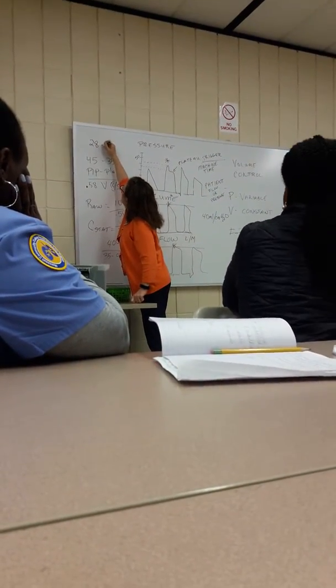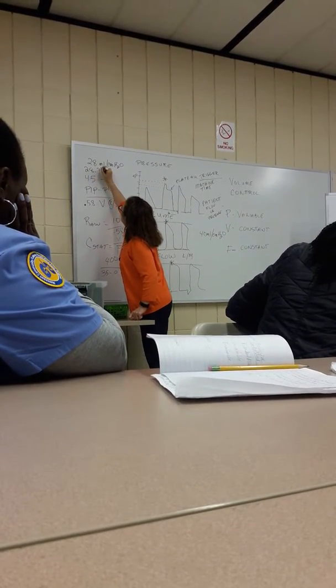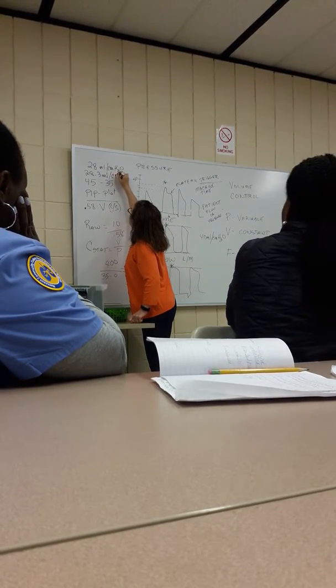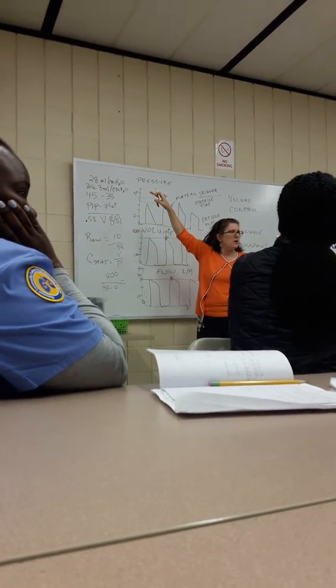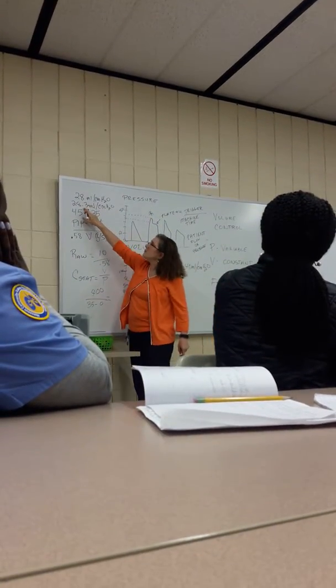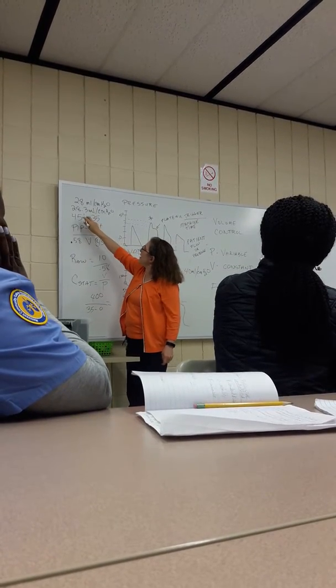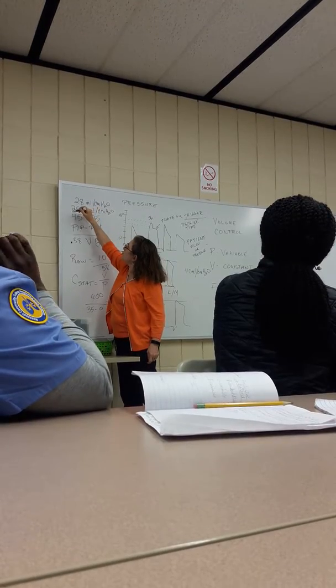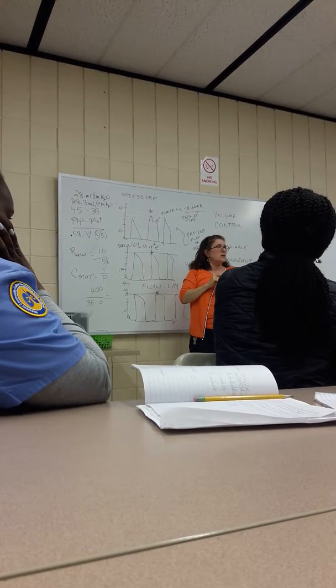Well, if I had 28 mils per centimeter of water, but I could also have 28.3 mils, there's a decimal point there. But the whole number is a fraction, it's not a whole number. Is compliance always a fraction when you put it in liters?